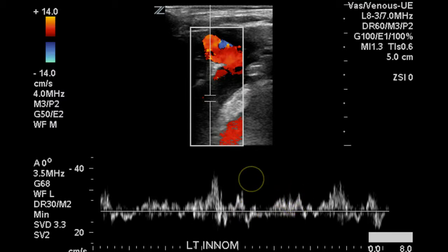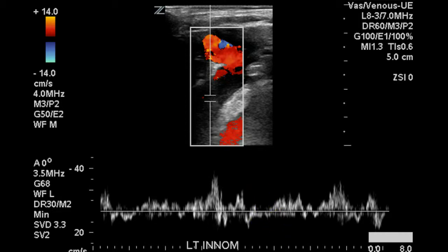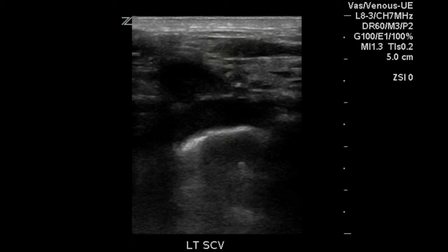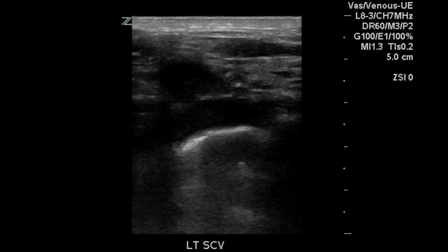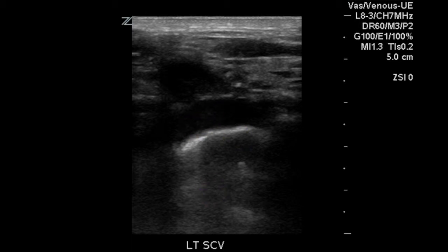Remember that superimposed upon the cardiac cycle is a respiratory phasicity in these central veins. This is a long axis image of the left subclavian vein. There is some echogenic material in it; however, this is likely due to high gain settings.